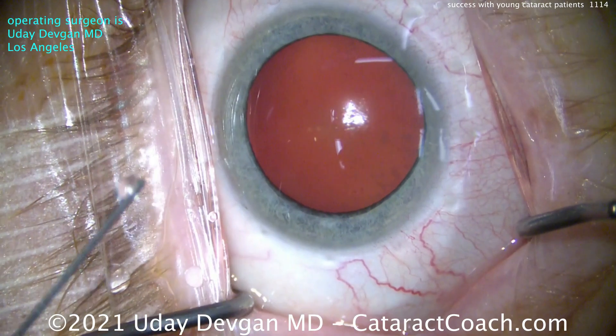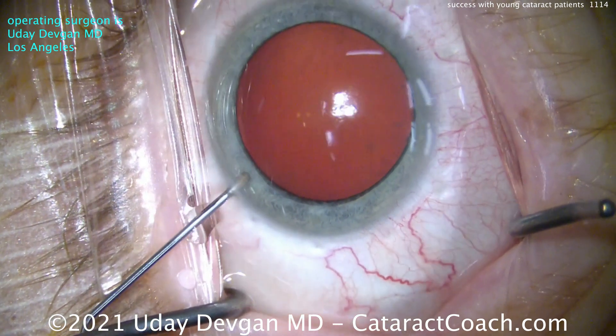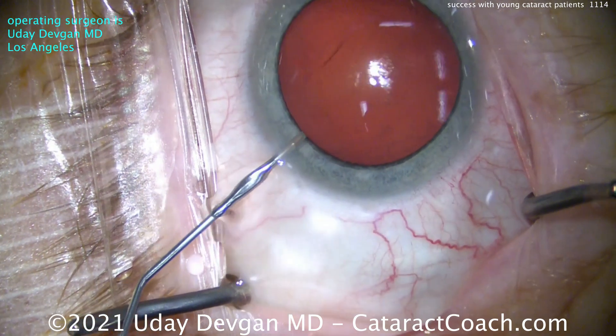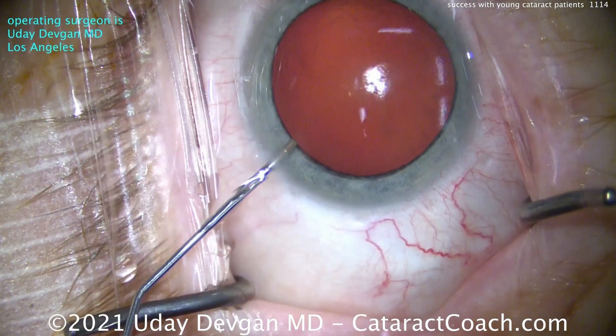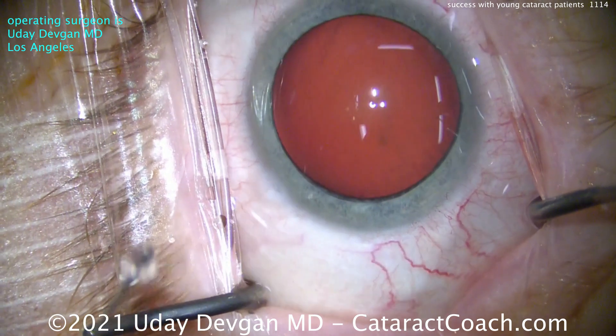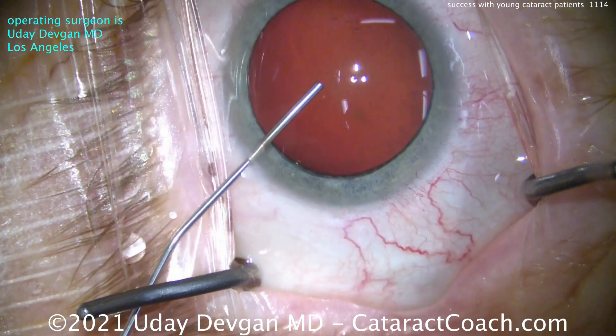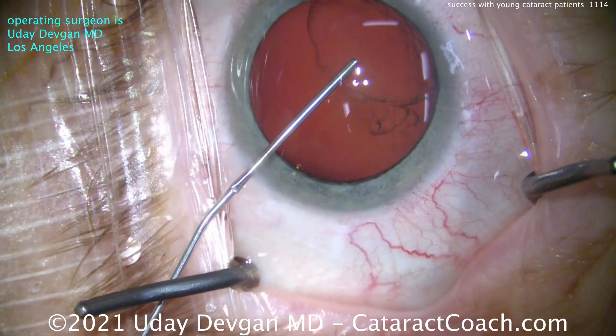Here's the surgery. The patient is going to have cataract surgery of this eye. The patient is relatively myopic, so the lens power is going to be about a 7.5 diopter lens, and that's to achieve a post-op refractive result of about minus 1.5 — and we'll talk about that refractive result too.